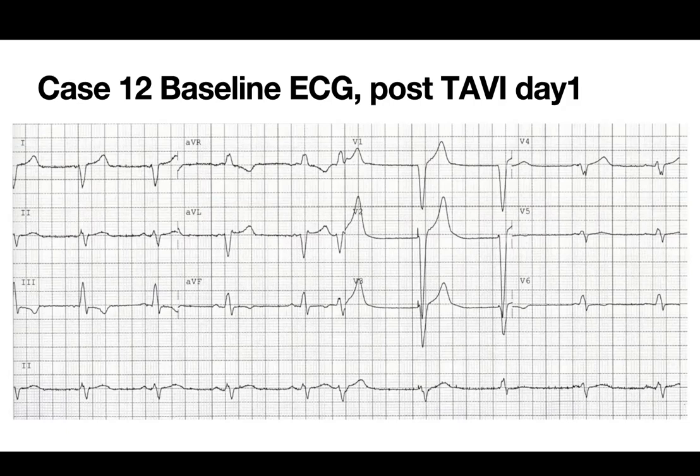This is the last one. A patient who had a TAVI, and post-TAVI left bundle, intermittent complete heart block, TVP is in place. So go next.